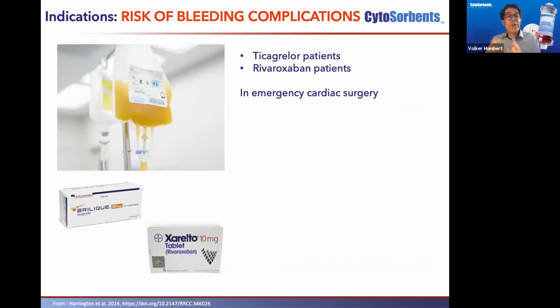Last but not least, for the intraoperative use of Cytosorb, I would like to speak about the risk of bleeding complications. As I said, this is a relatively new indication, and strictly speaking, this has nothing to do with hyperinflammation, but it's also the intraoperative use of Cytosorb therapy. And this is specifically given for patients on ticagrelor or rivaroxaban therapy in emergency cardiac surgery.